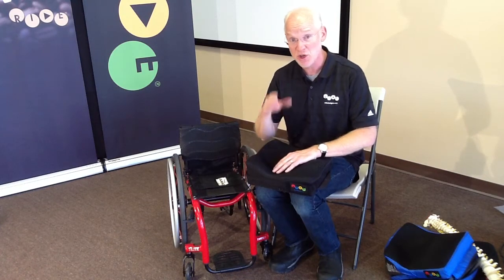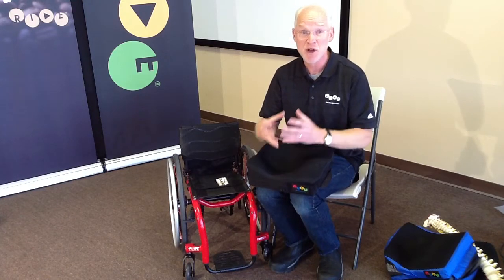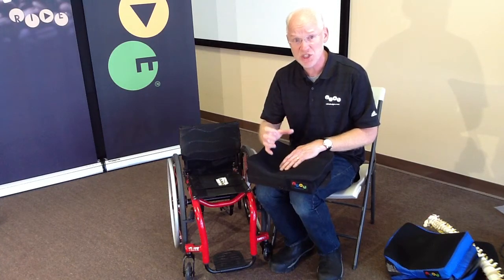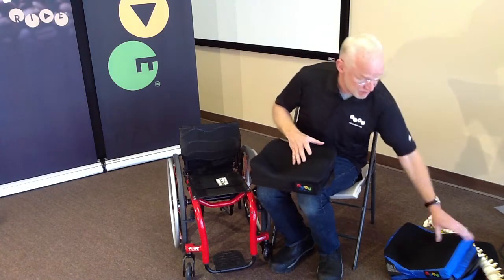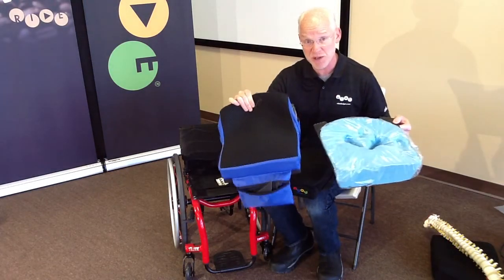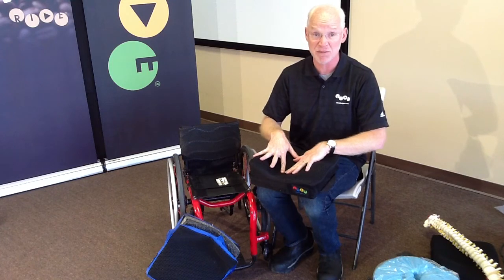So in review, your pediatric progression for cushions begins with our very simple forward cushion, which does a great job of promoting hips to the back of the chair, leveling the pelvis. If your forward cushion evaluation does not yield sufficient results, you can progress up to an evaluation on the Evaluator. If this doesn't work, capture the shape in the simulator. Whether the Evaluator or the simulator approach is taken for custom, what you're going to get is the Ride Custom Cushion, which is appropriate for that growing and developing child.